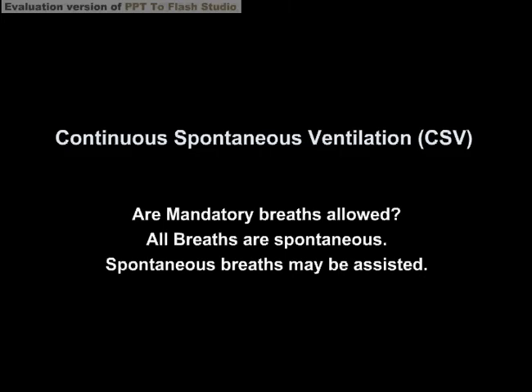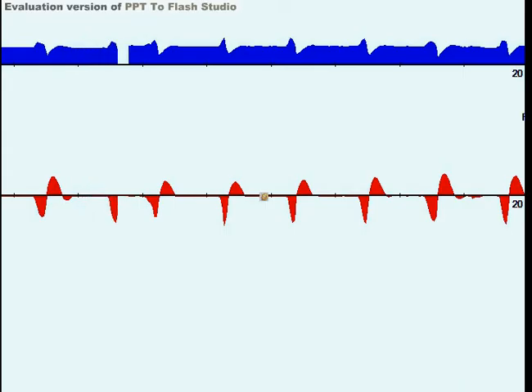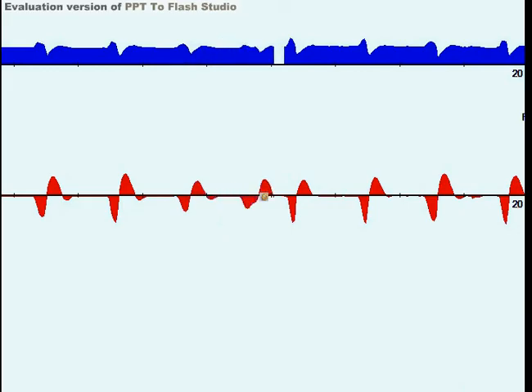With continuous spontaneous ventilation, we ask a couple of questions: Are mandatory breaths allowed during the breathing phase? Are all the breaths spontaneous? One thing to point out is that spontaneous breaths may be assisted, either by pressure support or another form of assistance. A great example of CSV is CPAP — here's a patient breathing on approximately five centimeters of water CPAP. The patient controls their whole inspiratory phase, and with CPAP, there are no mandatory breaths allowed; all breaths are spontaneous.